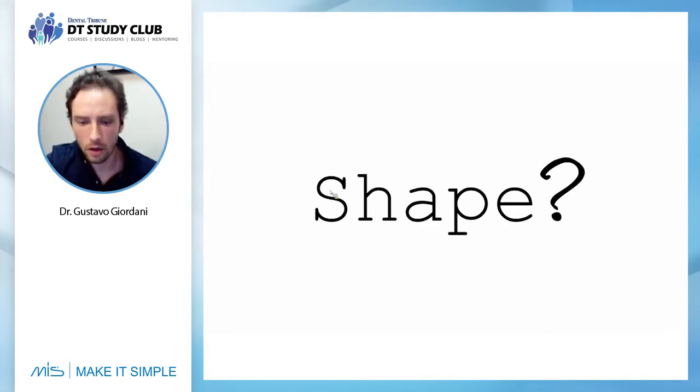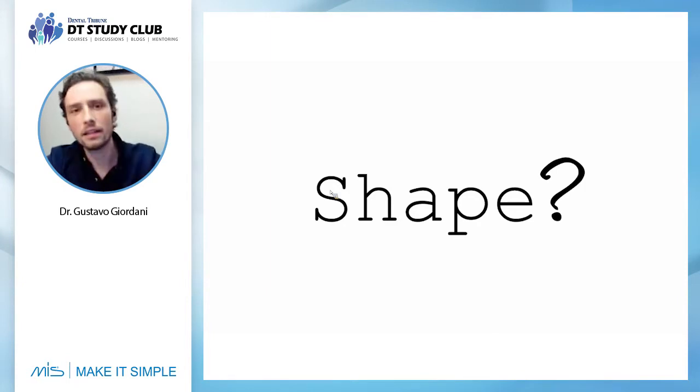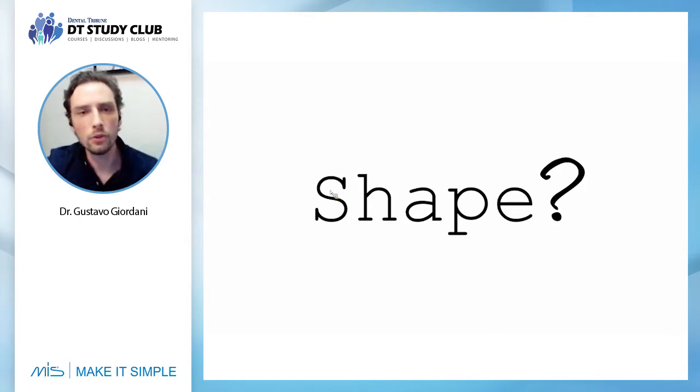So, prosthetically speaking, what is the biggest advantage of the digital workflow in dentistry? It's when you go through the software and you use the libraries of natural shapes, which is really amazing. So we can go inside the software, we can select shapes from a natural donor or natural shapes, and we do a digital mock-up. We print the model, and then we do our mock-up.